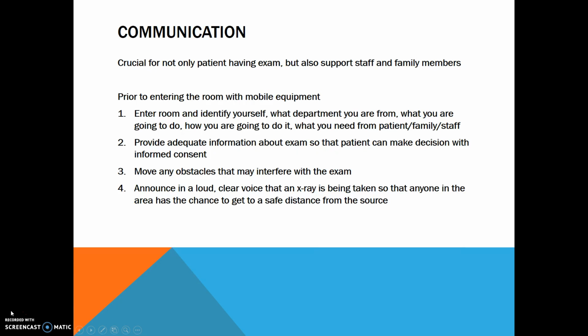Communication is crucial not only for the patient that's having the exam done, but also for support staff and family members. Prior to entering the room with mobile equipment, you should enter the room yourself and identify yourself, what department you are from and what you're going to do, how you are going to do it, and what you need from the patient, family, or staff.